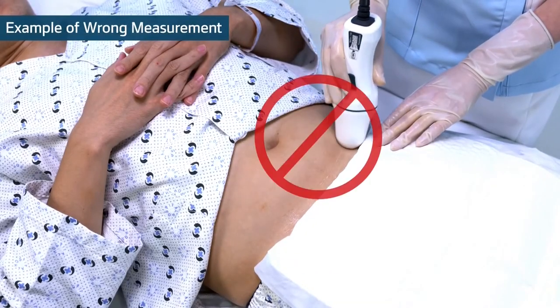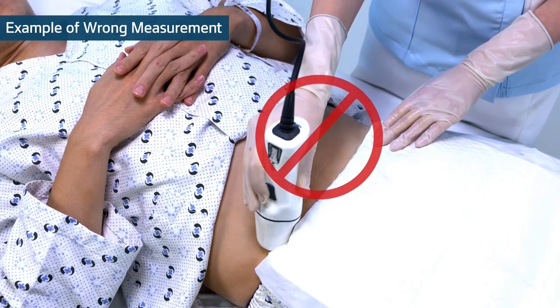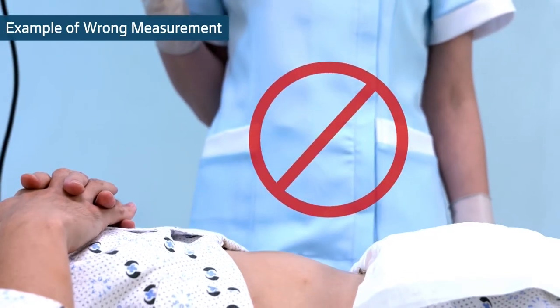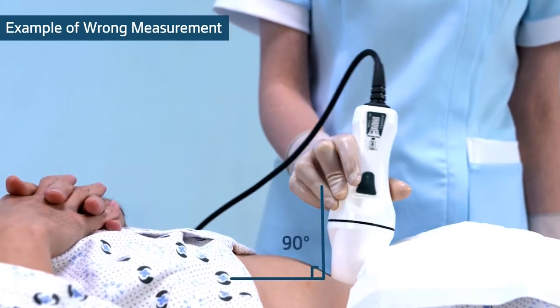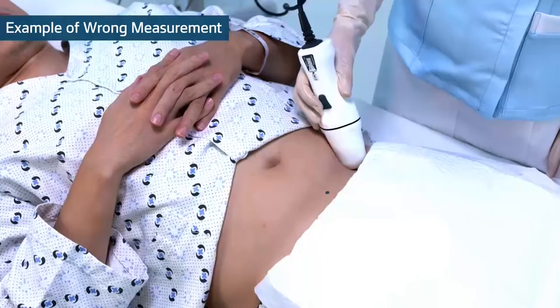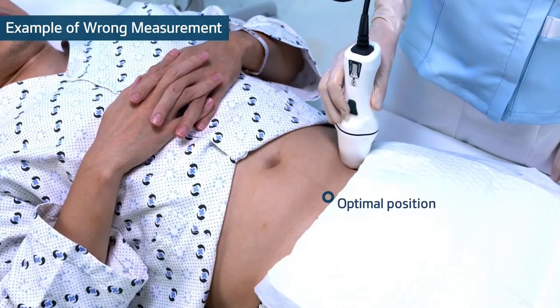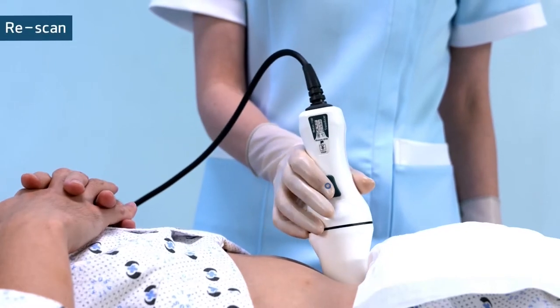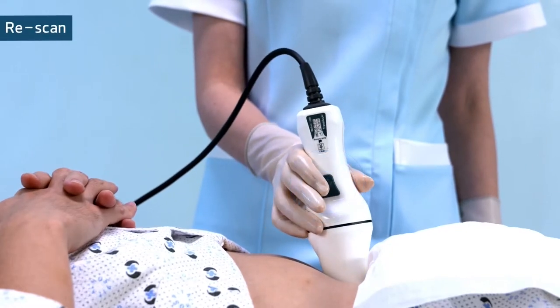Do not move the probe side to side. Do not lift the probe until the scan is completed. Do not tilt the probe over 90 degrees. Place the probe in the optimal position. If you need to re-scan, simply press the scan button again.